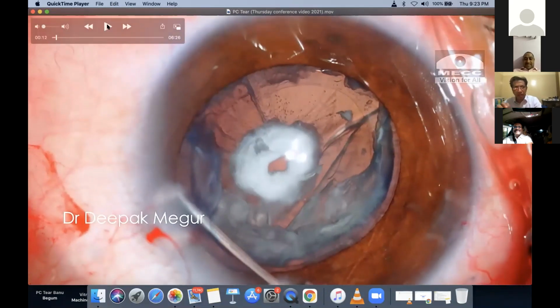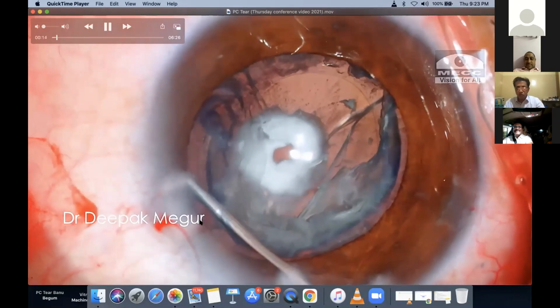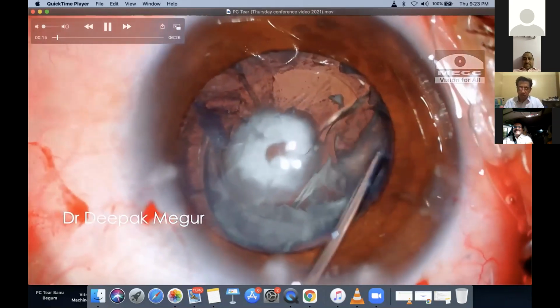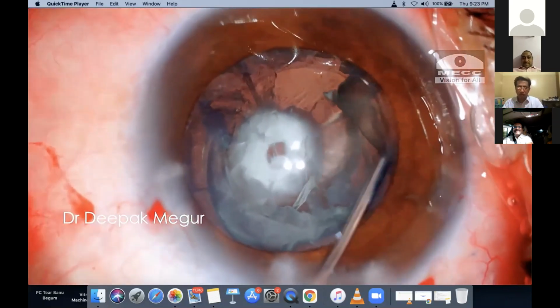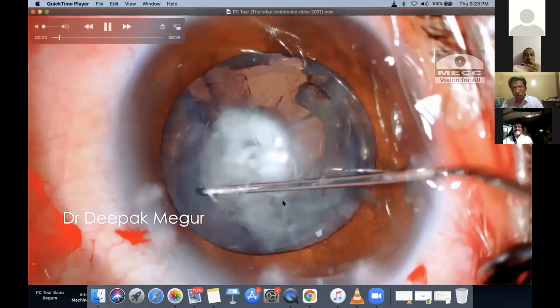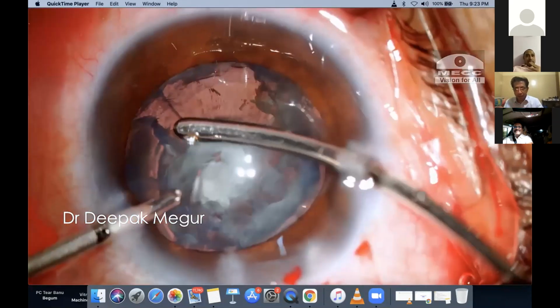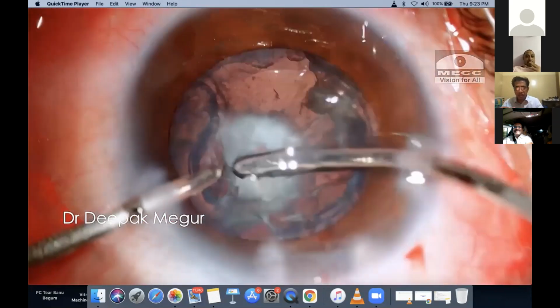At this stage, I'm not sure that the PC tear has happened, but I am suspecting that it could be there already. Now we have an epinucleus layer and a cortex inside. So I'm using dispersive OVD to do some visco dissection to gently maneuver the epinucleus out. The nucleus is out here, and it is quite tricky to remove this soft epinucleus and cortex. So I'm using my bimanual to engage it and remove.